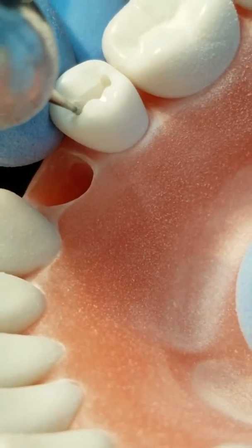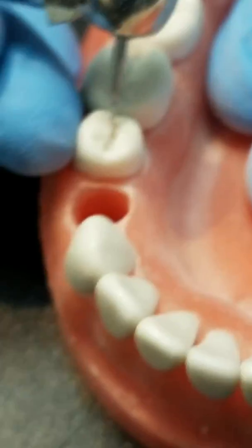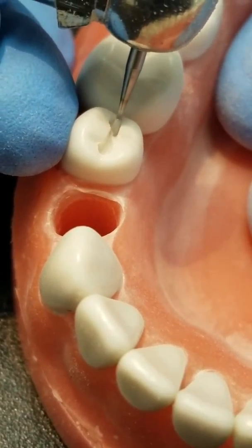Once again here I'm making the diverging walls, changing the angle of the bur slightly. Just remember that the mesial and the distal walls have to diverge, and every other wall will converge.